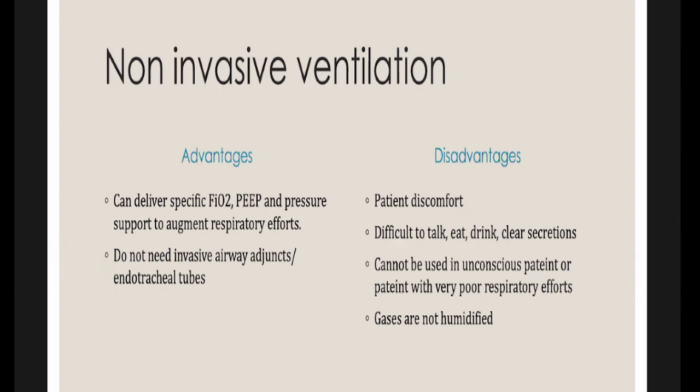So let's discuss further about non-invasive ventilation, and there are a lot of advantages. In non-invasive ventilation, in the CPAP and BiPAP modes, you can deliver a specific fraction of inspired oxygen, a PEEP and a pressure support, so that it will augment the respiratory efforts. So you can reduce the work of breathing of the patient. You can let him rest a little bit. You are also supporting him, and you do not need invasive airway adjuncts like endotracheal tubes. So a lot of hassle and bustle related to ET tubes is taken off by these non-invasive ventilation methods.